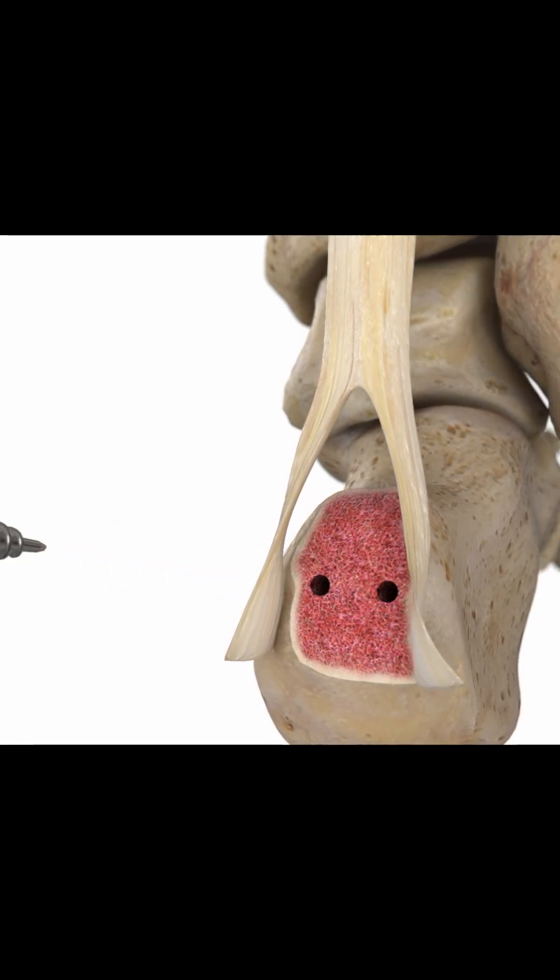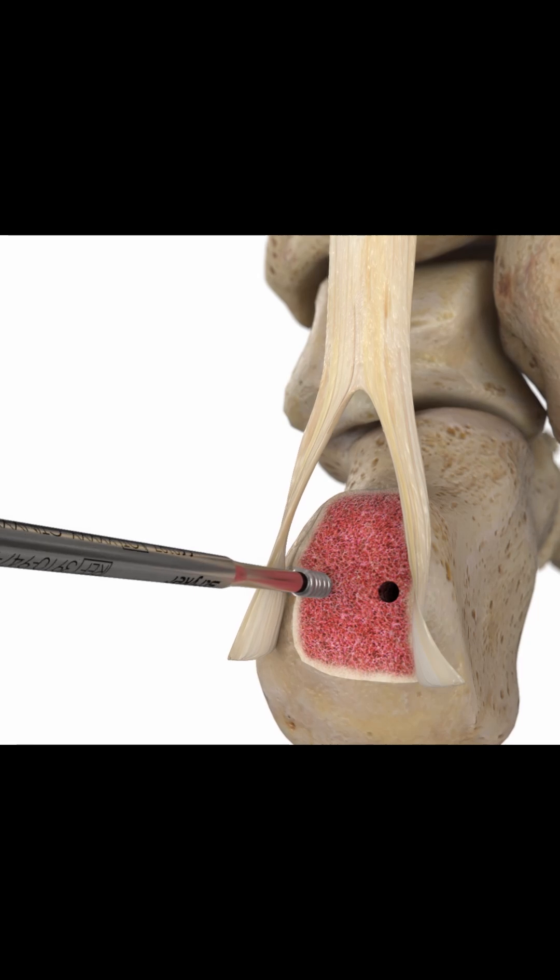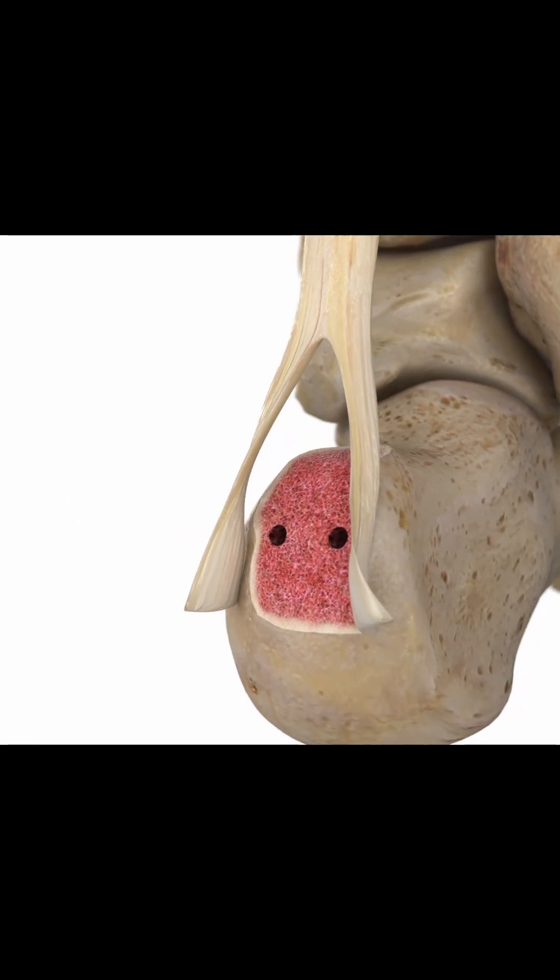After drilling two proximal holes, use the 4.75 mm tap to prep the proximal row. Insert the two 4.75 mm Alphavent anchors.